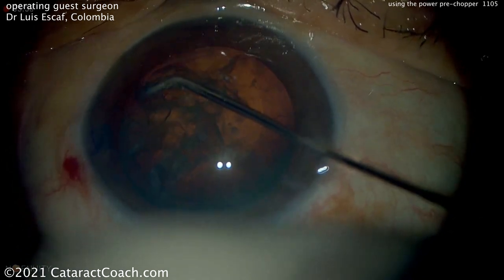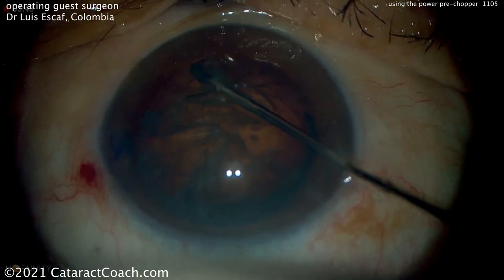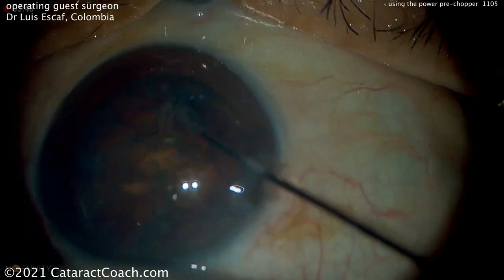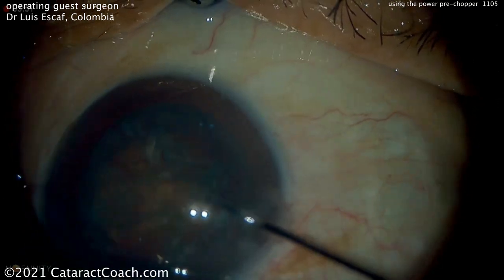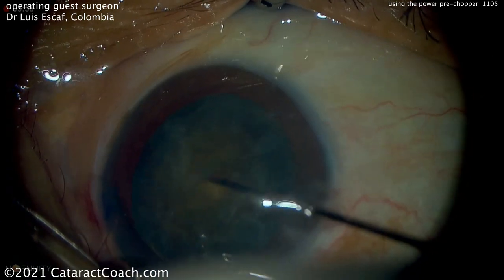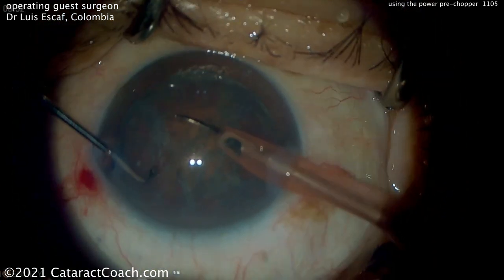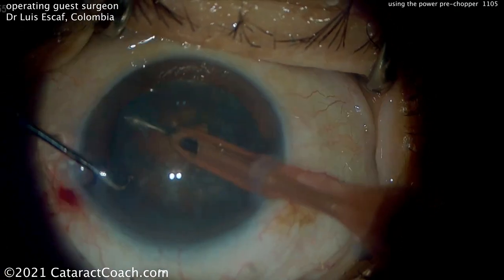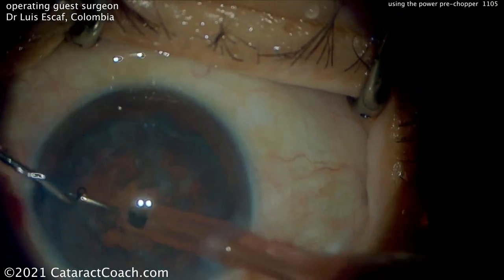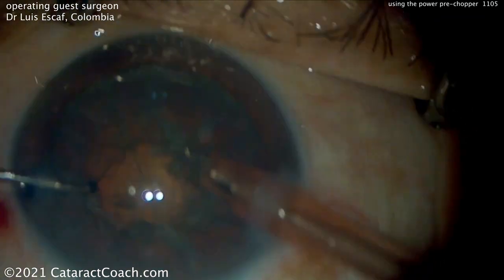Now this pre-chopper that he's going to use has one difference compared to most, and that is it uses ultrasonic energy. In other words, it's basically attached like you would attach a needle to the phaco tip. And you can use ultrasonic energy to help this chopper penetrate even a very dense nucleus. Now this nucleus doesn't have too much nuclear density, but there's that chopper — you see it's attached to the phaco tip. It doesn't aspirate at all. You use the infusion to keep the eye inflated, and then the ultrasonic energy will help drive this into even a very dense nucleus.